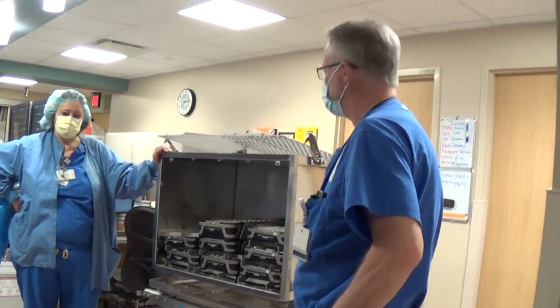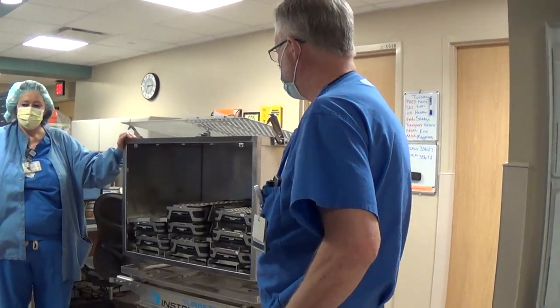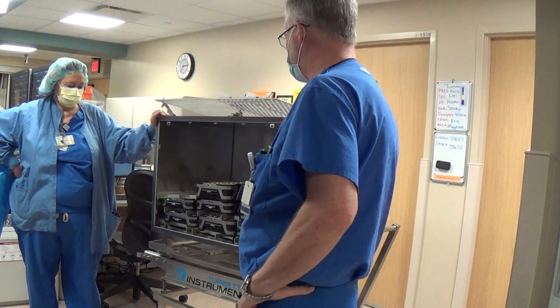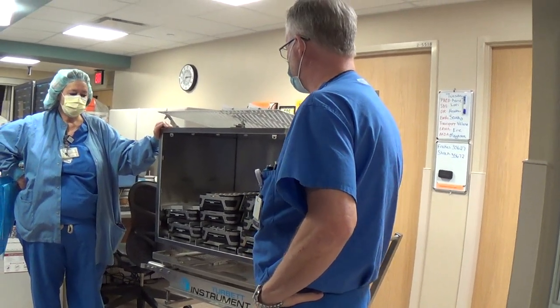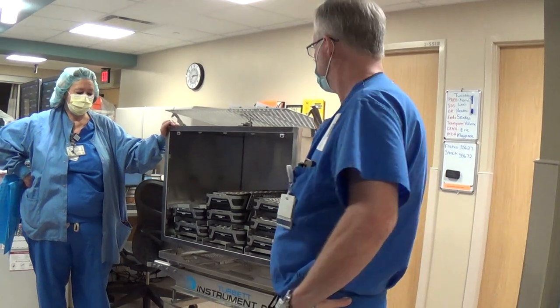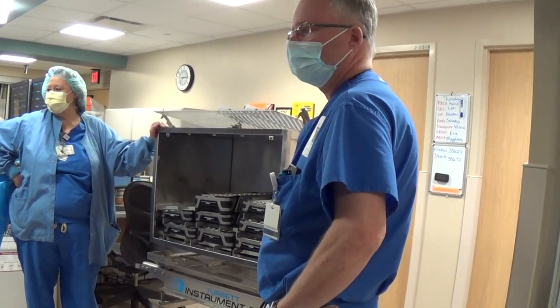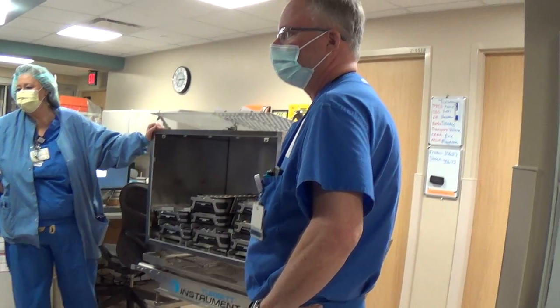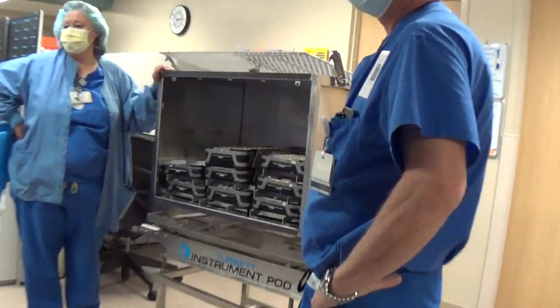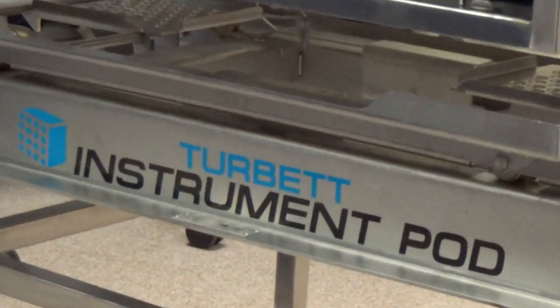Do any of you want to come up and look? There are YouTube videos — if you look up Turbit, there's one that shows loading it and one showing the team unloading it. Anybody have any other questions? Anybody seen this before? So everything inside is considered sterile. If the tech, when they're reaching in, hits the back wall trying to get their tray, it's still sterile — like the inside of the container.